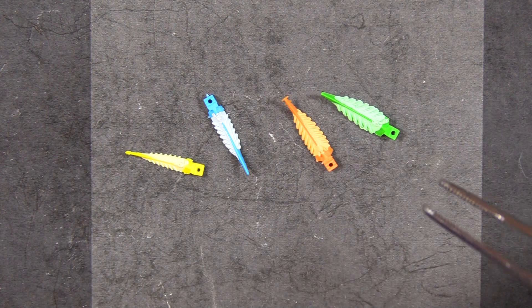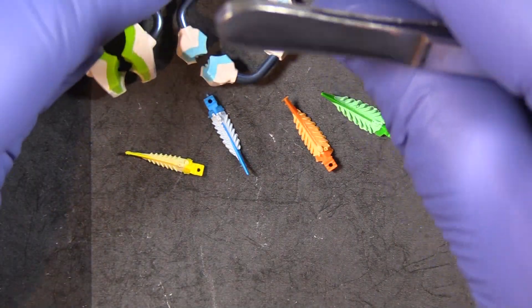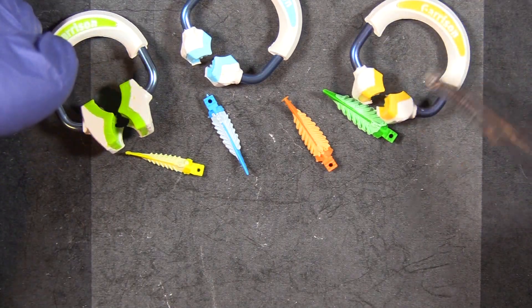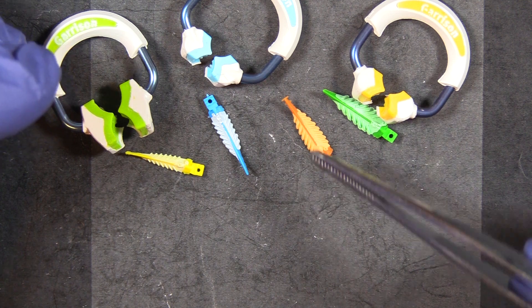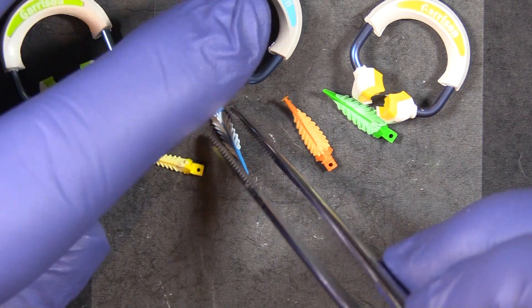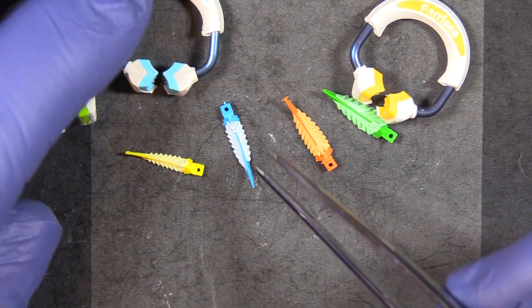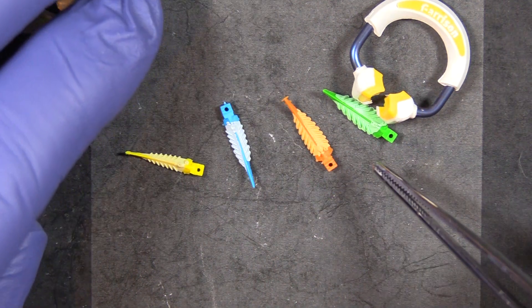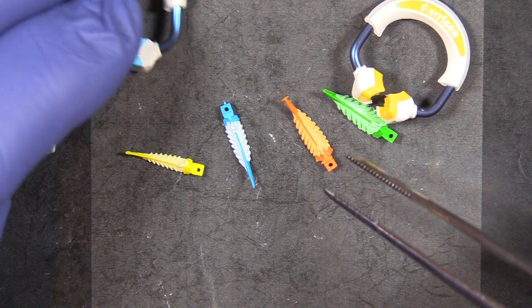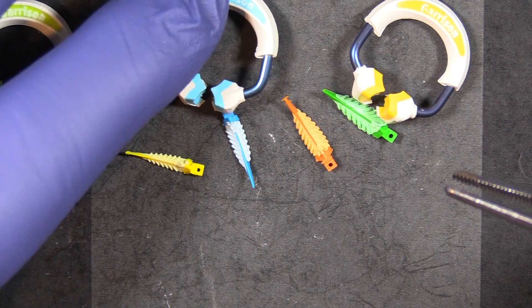A common question is about color-coded wedges: if I'm using an orange ring, should I use an orange wedge? The answer is emphatically no. When selecting a wedge, what matters is how it fits the interproximal space, not what ring you're using. Use whatever wedge appropriately fits the interproximal space, then select the appropriate ring depending on the type of restoration you're working on.